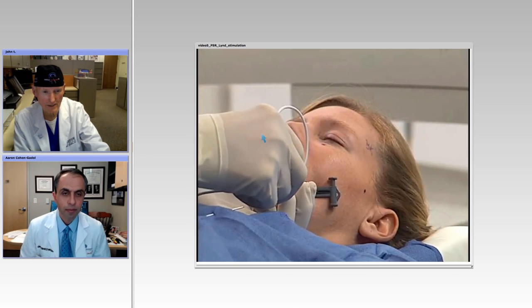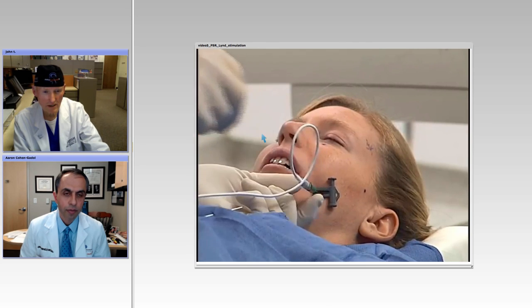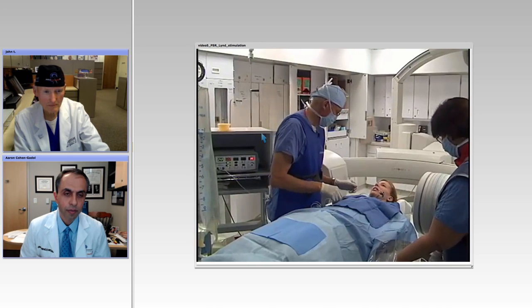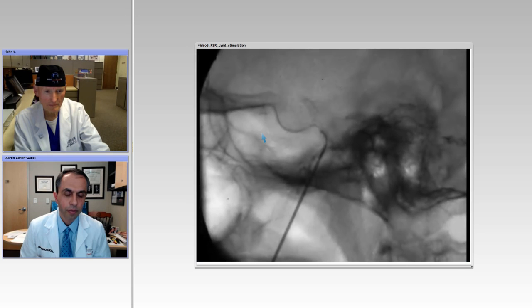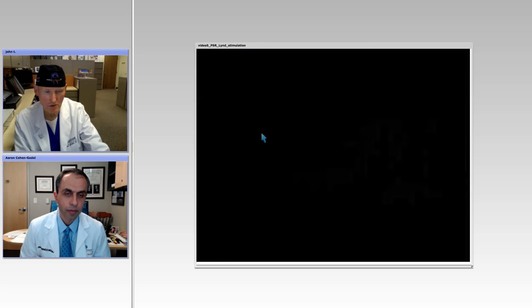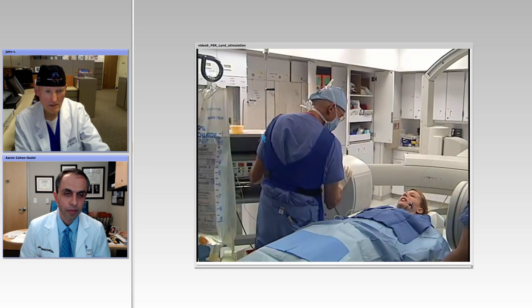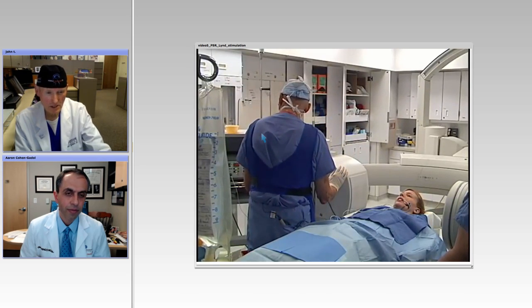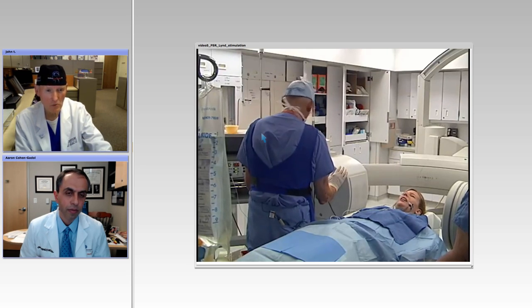That's why we enter the foramen ovale on the medial anterior aspect. So you see here, the electrode is placed inside the cannula, and we begin by stimulating. There's a fluoroscopic view showing exactly where the electrode is located. Now the patient will hear us asking questions about where they feel the electrical shock. This patient says on the video that she feels it exactly in the mid portion of the face. So that's exactly where we want it in her case.